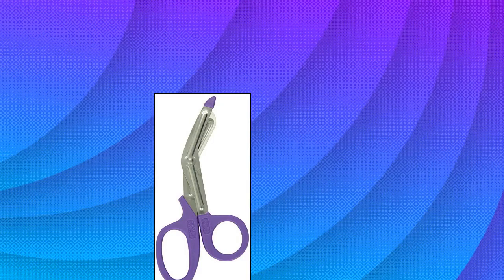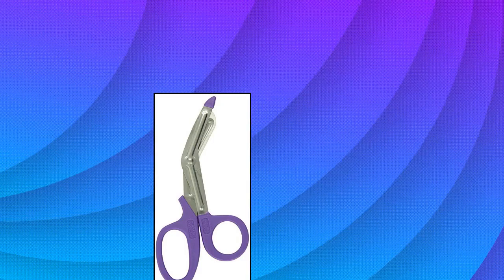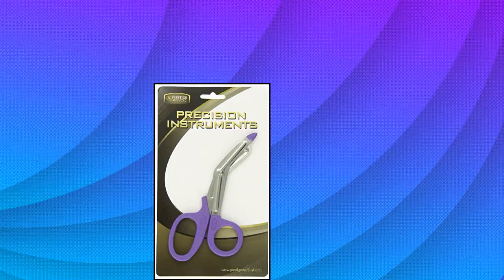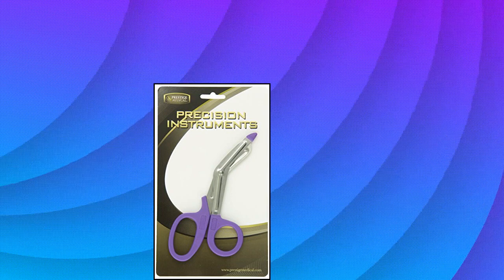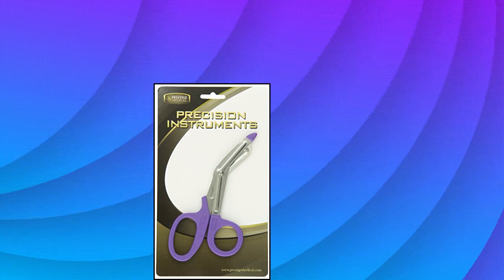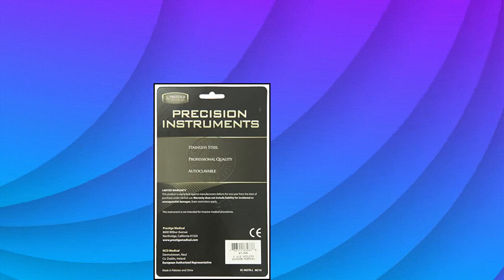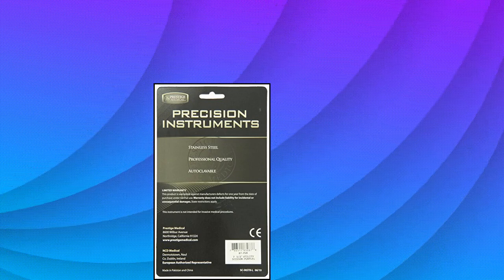Prestige Medical Utility Scissors, purple, 7.5-inch. The 7.5 EMT Utility Scissors are made of Japanese 420 stainless steel. The serrations on these shears are milled, not stamped, for cutting through tough clothing and bandages. Autoclavable at 143 degrees Celsius, 290 degrees Fahrenheit.